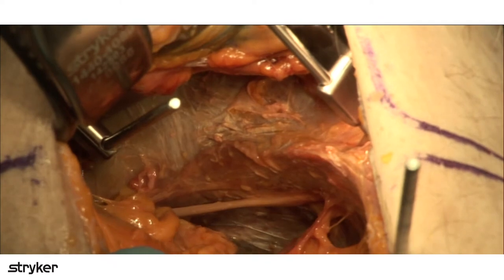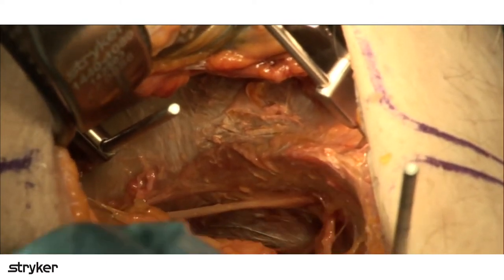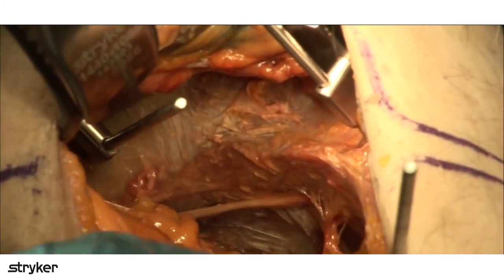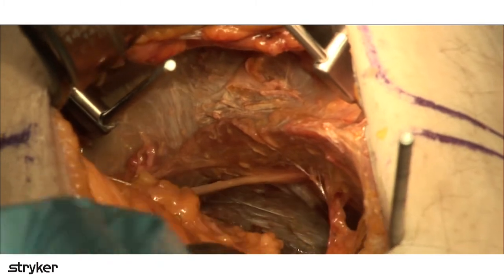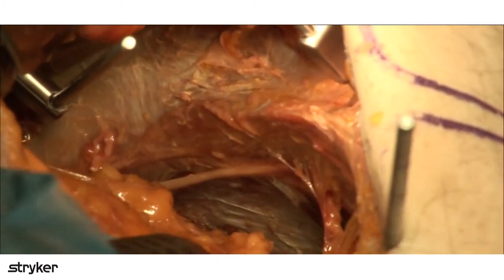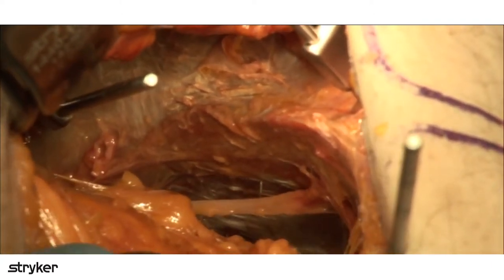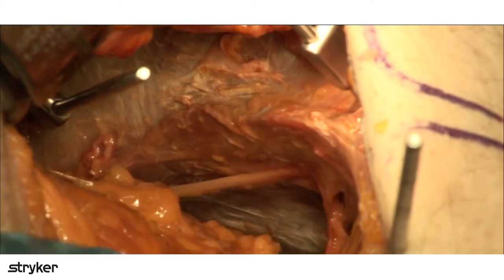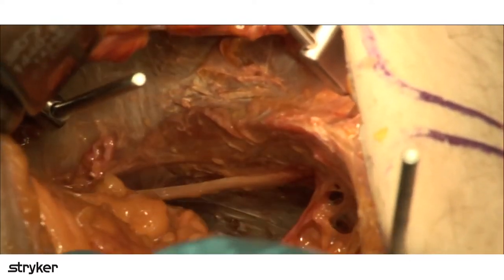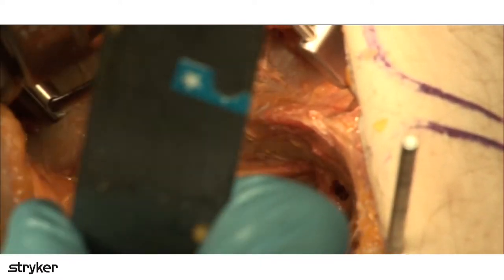And you're going to take this release of the obturator internus muscle here, all right, you're going to take this off the quadrilateral surface all the way down to here. It's going to be really hard to show it on the camera, but this is the ischial spine. So I'm down to the ischial spine, and if you watch my cob right there, you can see it fall into the lesser notch. Maybe switch back. Okay, so the ischial spine is really pretty much the base of your exposure, and then back here, I'm going to put the malleable back in now.